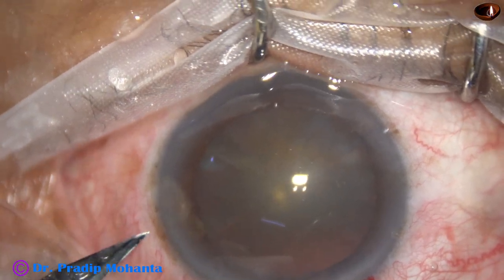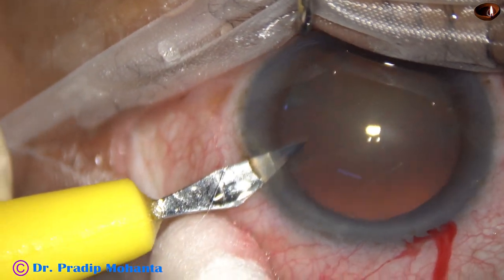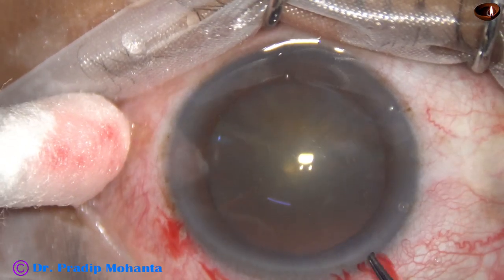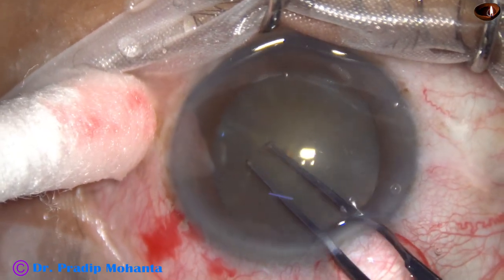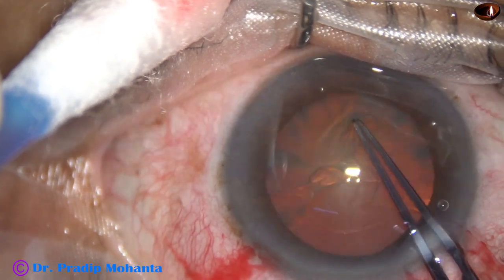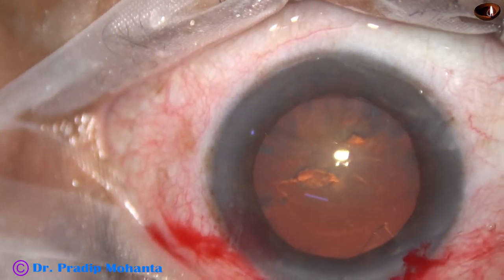The side port is made on the left side of the main incision, about 3 clock hours away. And now, capsulorhexis. Capsulorhexis is done with the help of utrata forceps. The capsular tag is raised by the tip of the utrata, held and guided anticlockwise all around to get an adequate size rhexis of about 5.5 mm.